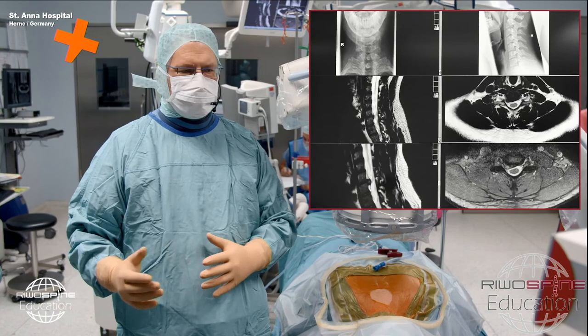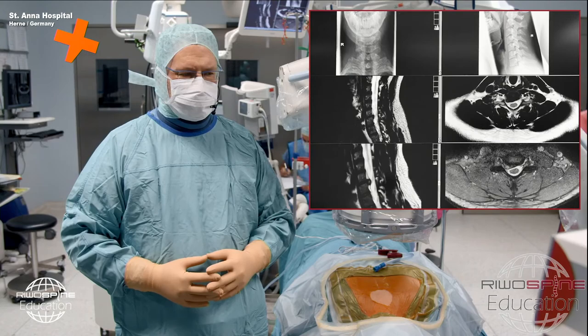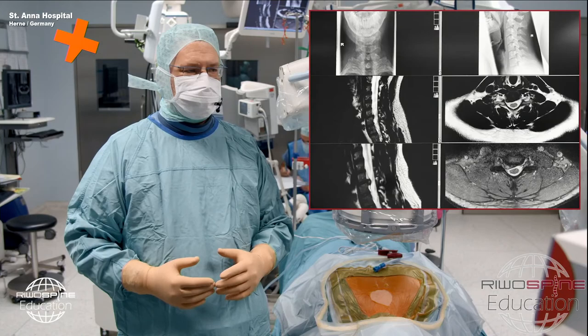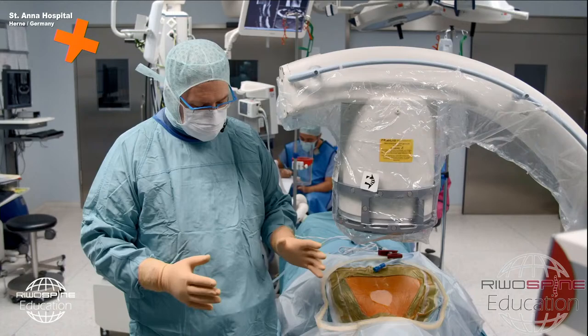In the middle, we see the actual MRI. It is not a fresh herniation anymore, but the patient still has his radicular problems. So we decided to do an endoscopic dorsal decompression. We will not find, I think, a fresh piece. We will see adhesions, but at least this is a good case to show the principles of an endoscopic dorsal procedure.